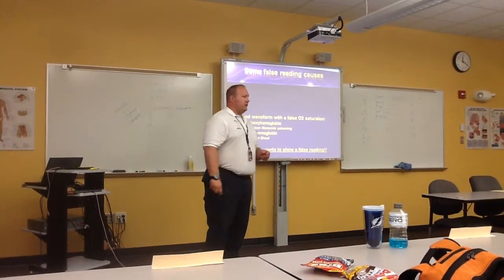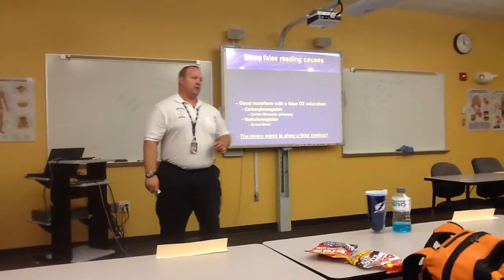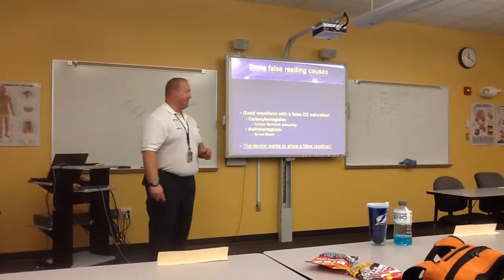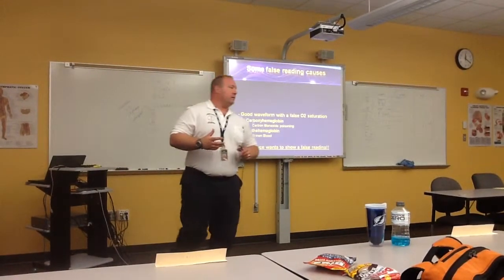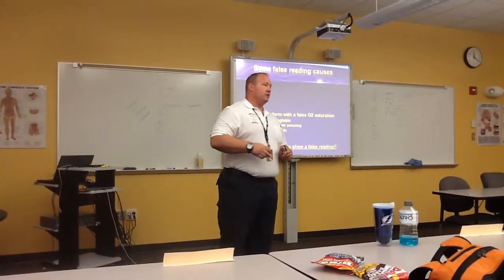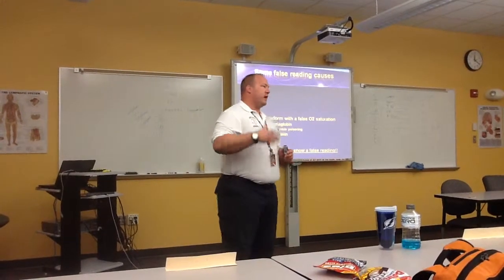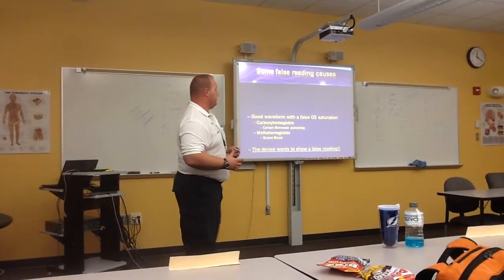There's also the condition of a good waveform with a false O2 saturation. There are 2 specific things that come to mind when we talk about this. Carboxyhemoglobin, or CO poisoning. Carbon monoxide absorbs to hemoglobin 200 times greater than oxygen. So if you have a patient that's been exposed, their pulse ox may say 100%, and they're actually hypoxic. They're actually starving for oxygen. High flow O2 is the treatment for it.